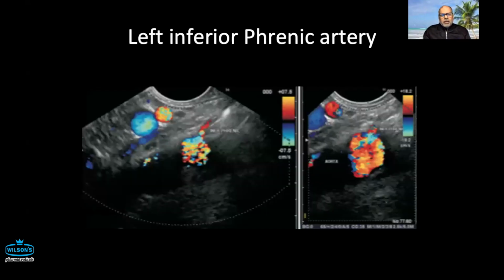Yeah. So a little bit, because sometimes when you rotate the scope, actually in the thorax on the aorta, before just entering into the abdomen, you sometimes see this structure and you can get confused. Occasionally you see this phrenic artery, just forget about that.